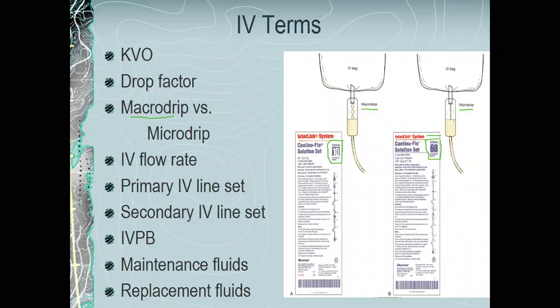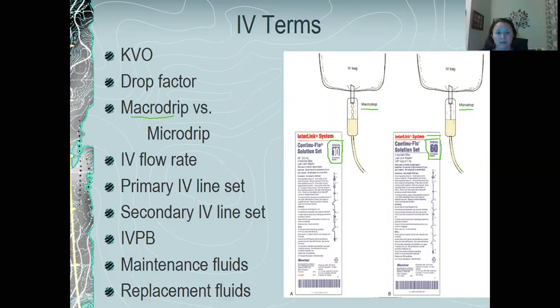Okay, your primary IV line set is going to be those continuous. Remember, when we talk about primary, we're talking about a continuous administration. I am going to stop sharing for just a minute and turn my camera back on.